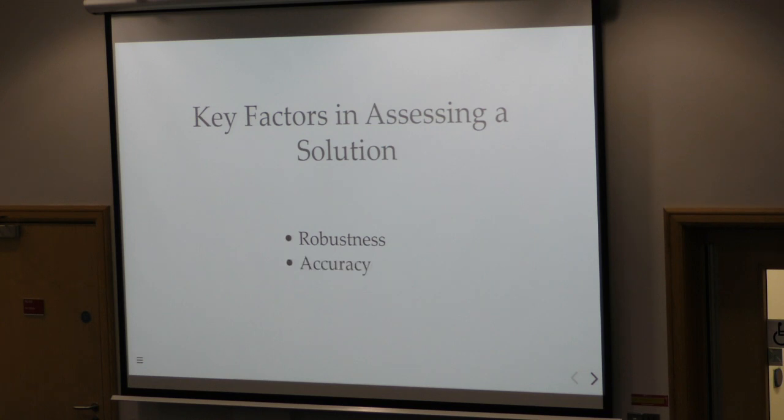Accuracy: you want your boundaries to be as close as perfectly possible to what the actual physical shapes described in these images. It makes a significant difference if you're making decisions for a surgery based on these, because it could be the difference between someone living or dying. Reproducibility: you want the solution to produce consistent results every time. You don't want differing results, because ultimately this is meant to represent objective reality of the 3D shape, and you want it to be efficient and accomplish it in a reasonable scale of time.